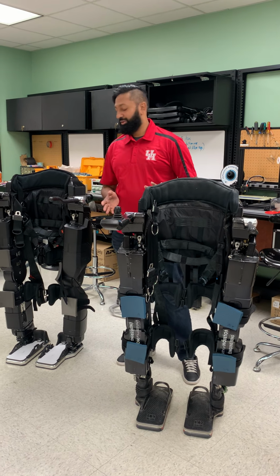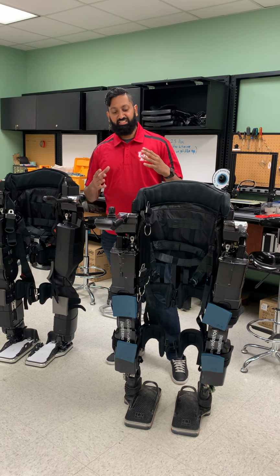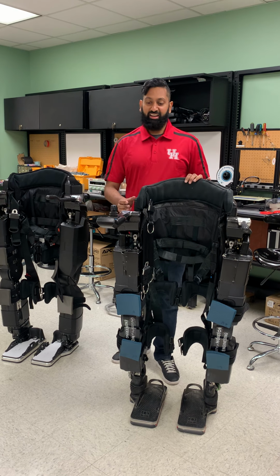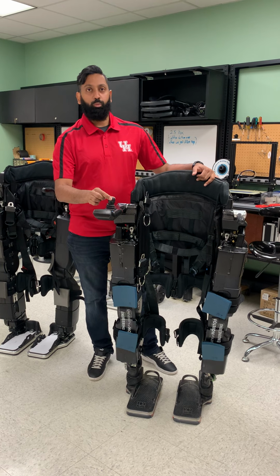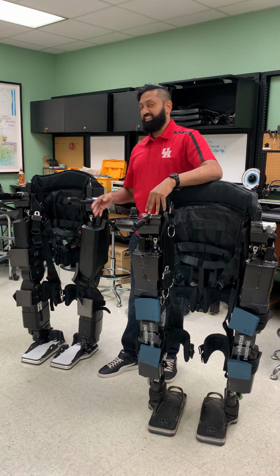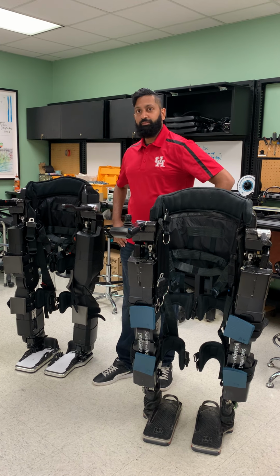And what you may notice is that they're pretty bulky, but these are very special because they're designed to be completely weight supporting and completely stable. So normally a fully paralyzed spinal cord injury patient could be using this to walk around, but now we're trying to bypass these joysticks so they can just consciously think about walking and go.